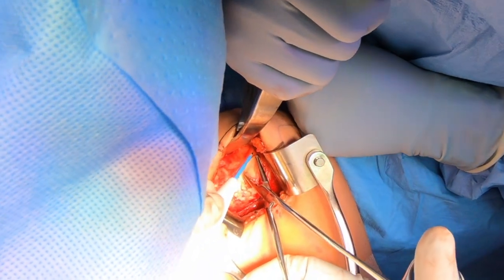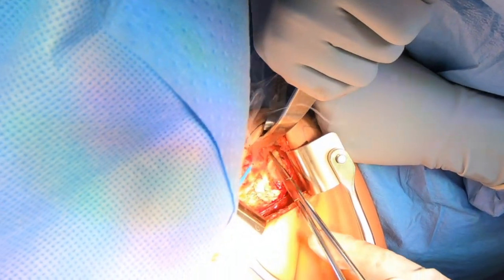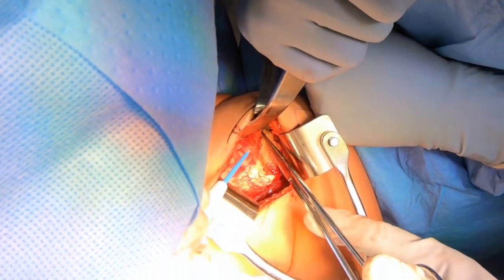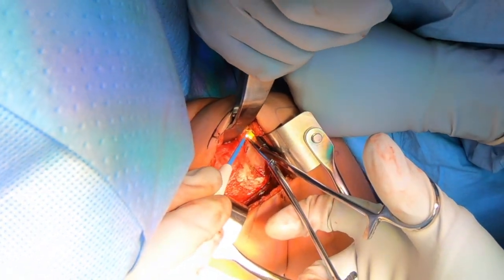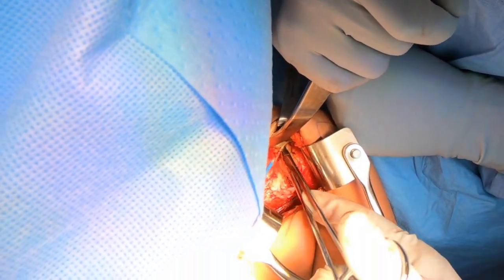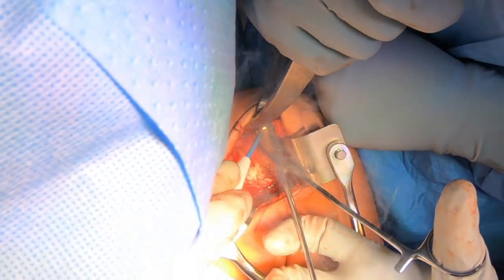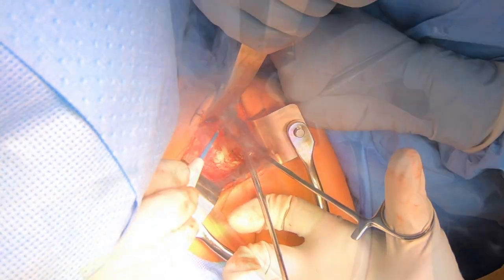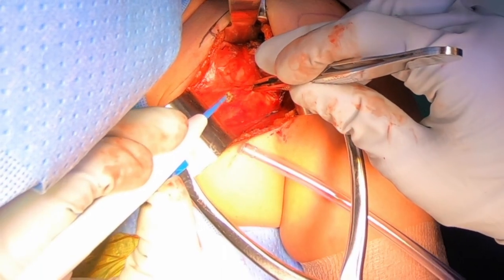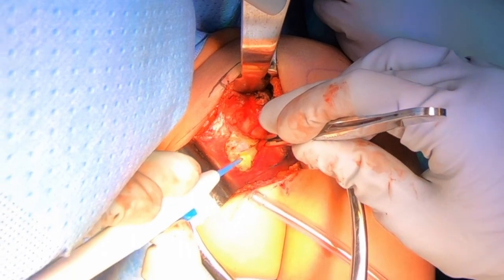As we dissect up, there's a ligament connected to this bone called the coracoacromial ligament, and we're going to cut that ligament so that it's still attached to the coracoid so that we can use that ligament at the end of the procedure to rebuild the capsule of the shoulder. You can see me here using a clamp to carefully cut that ligament while taking care not to damage the rotator cuff beneath. We have to be very careful here as all the nerves that go to the arm are immediately beneath where we're working.